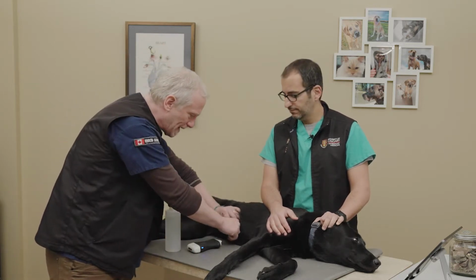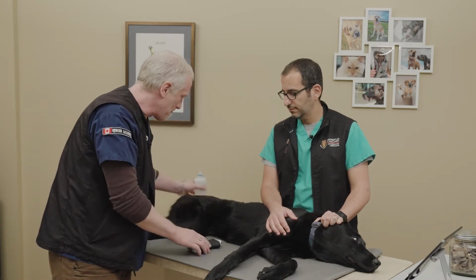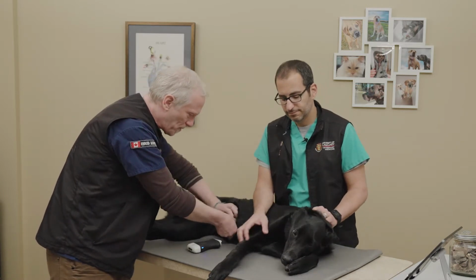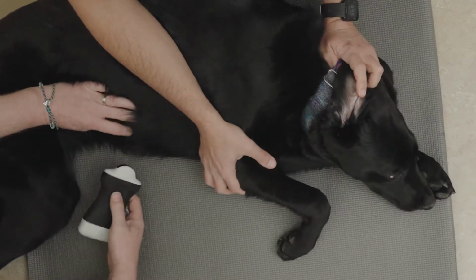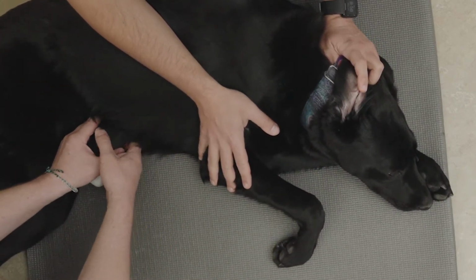find that spot where you can palpate the subxiphoid site, and then when you've got that site located, again, we separate the fur, we apply alcohol once you can see the skin, and then what we're going to do is we're going to place the probe exactly in that subxiphoid location. We're going to start, in this case, in long axis, again with the marker towards the head.